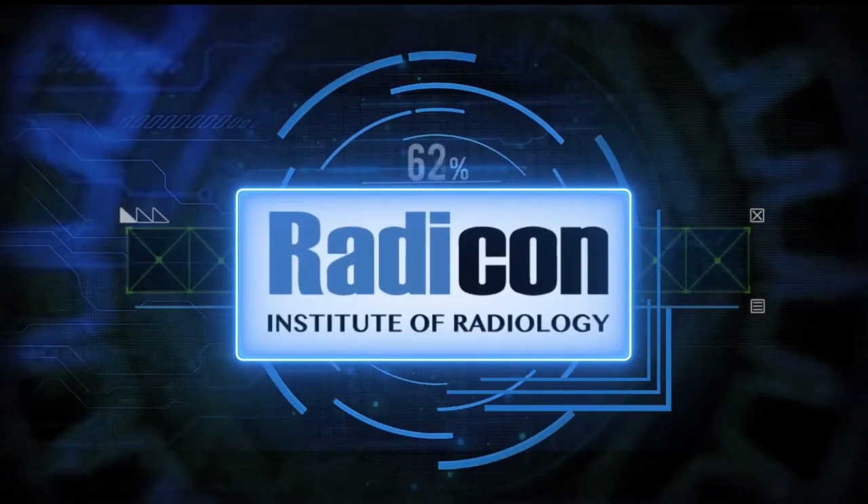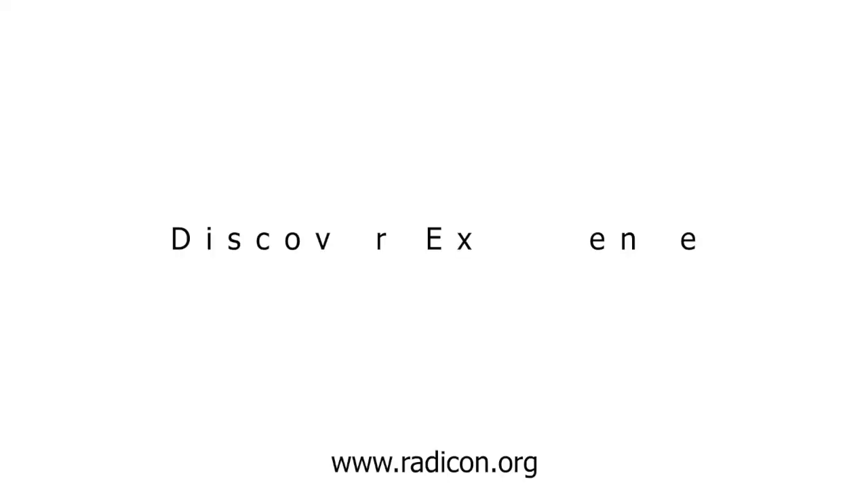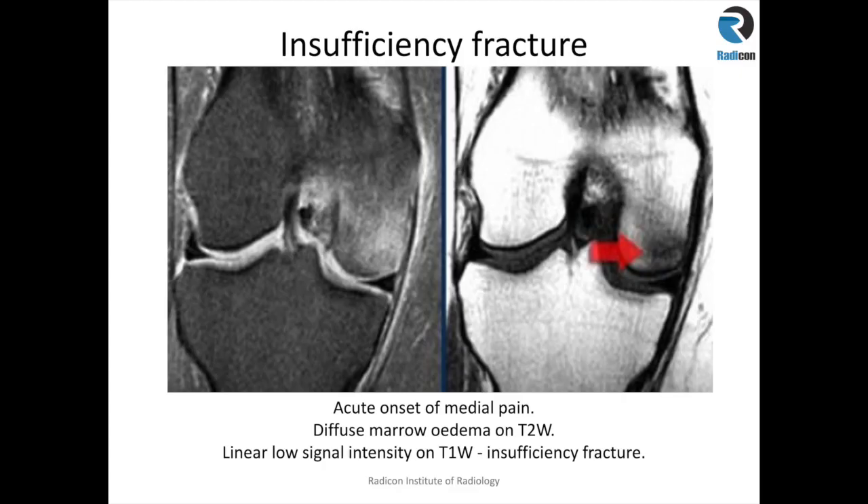You are watching Radicon. Insufficiency fracture or stress fracture are increasingly being recognized, partly due to low exposure to sunlight or vitamin D deficiency.